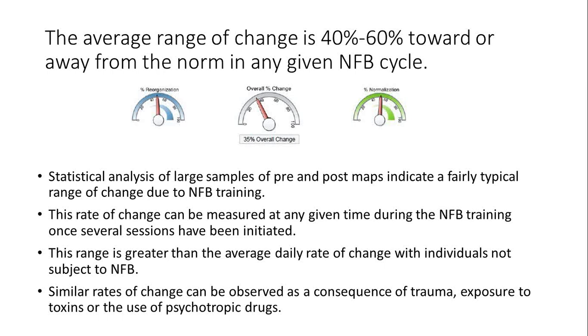Reorganization. That was 50%. Well, what we found from statistical analysis of large samples of pre and post maps is a fairly typical range of change due to neurofeedback training. These numbers I'm giving you are related to neurofeedback training.